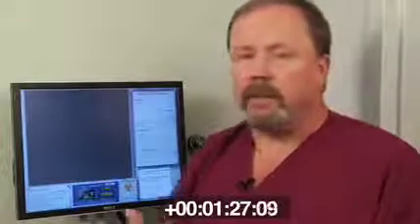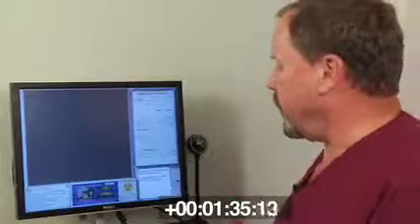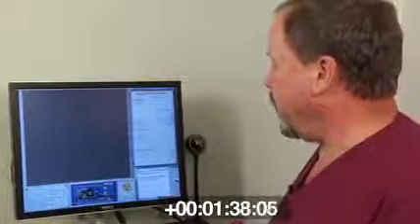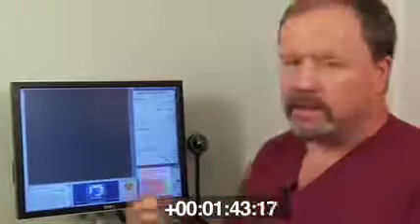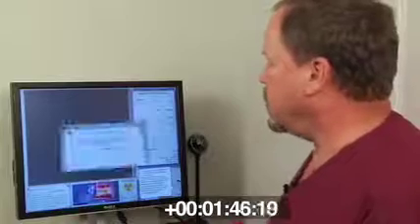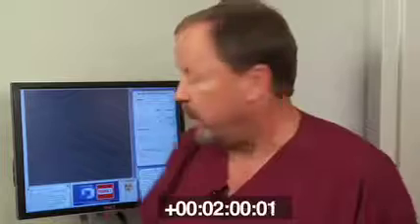And in most all cases you're probably going to use the wide area with the 512 images. If you have an endo problem, you're going to go with the smaller 5 centimeter screen using either 512 or the 1024 projections. So all we do on this is we click wide area, standard mode, and we go to proceed. So at this point the program will ask us to initialize the scanner. It's a real quick initialization that makes sure that the x-ray head and tube are all calibrated and ready to go. So it takes about 30 seconds, and then we're going to go in and seat the patient and go ahead and take the CBCT.